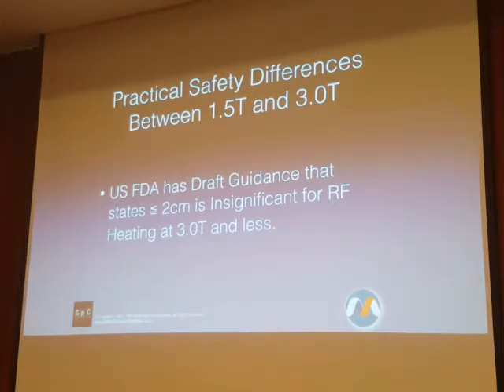Their draft guidance essentially says they're changing their criteria for testing, and the new criteria will essentially say, look, if you're 2 centimeters or smaller, if you're a coronary stent that's 2 centimeters or smaller, don't even bother doing the RF heating tests, because that is so small that for 3T and lower field strengths, there's essentially 0 opportunity for it to heat at that size.